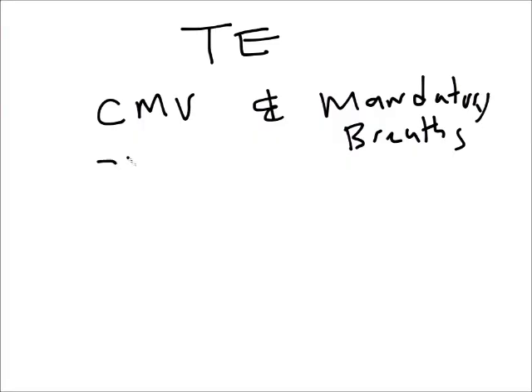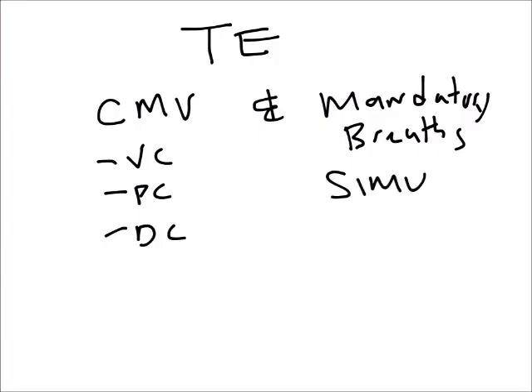So when we're thinking about CMV, this could be either volume control CMV, pressure control CMV, or even dual control CMV. And mandatory breaths, these could be the mandatory breaths that are within SIMV modes. So this could be volume control SIMV, pressure control SIMV, or dual control SIMV.